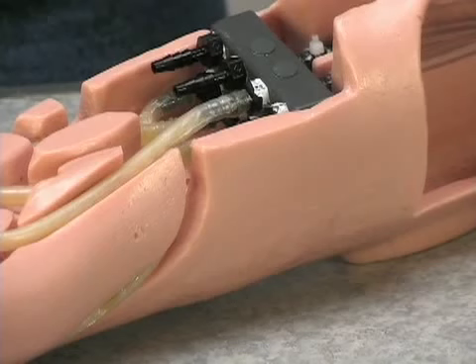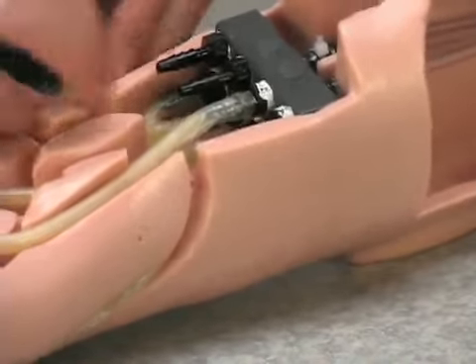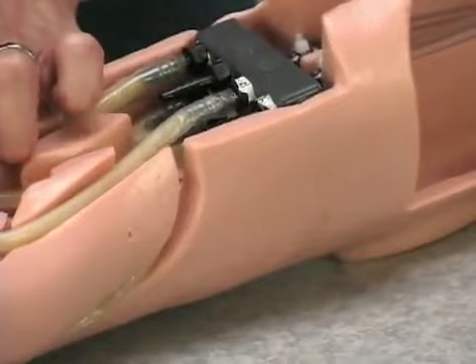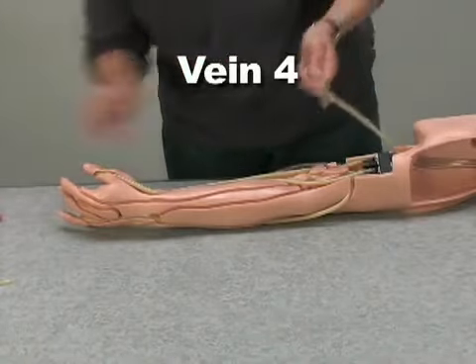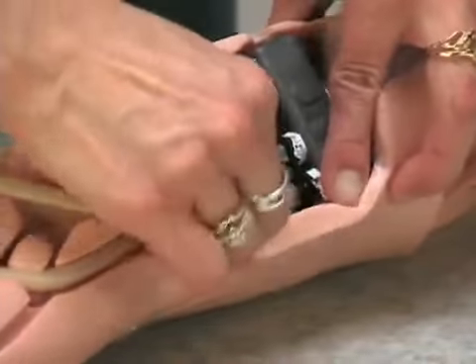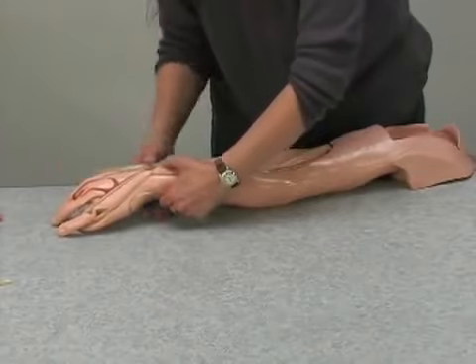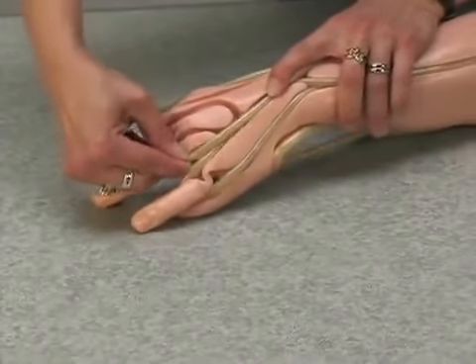Cut the vein to fit, lubricate, and connect to fitting number 5. Take the fourth and last vein, lubricate, and connect to fitting number 6. Press it into the channel, taking extra care to minimize pinching in the loops around the 2 fingers and the back of the hand.